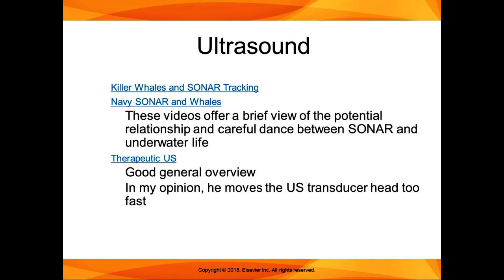So I think probably one of the therapeutic uses that everybody in the public is familiar with is the imaging that's used for ultrasound. But what we use it frequently for in the clinic in PT is for thermal or healing effects, the non-thermal effects. So ultrasound most effectively heats deep tissue with high collagen content, such as tendons, ligaments, and joint capsules and fascia. You can see how that would be a useful thing, to have that deep heating treatment that specifically targets those collagen tissues, which are so often the injuries that we're treating in PT.